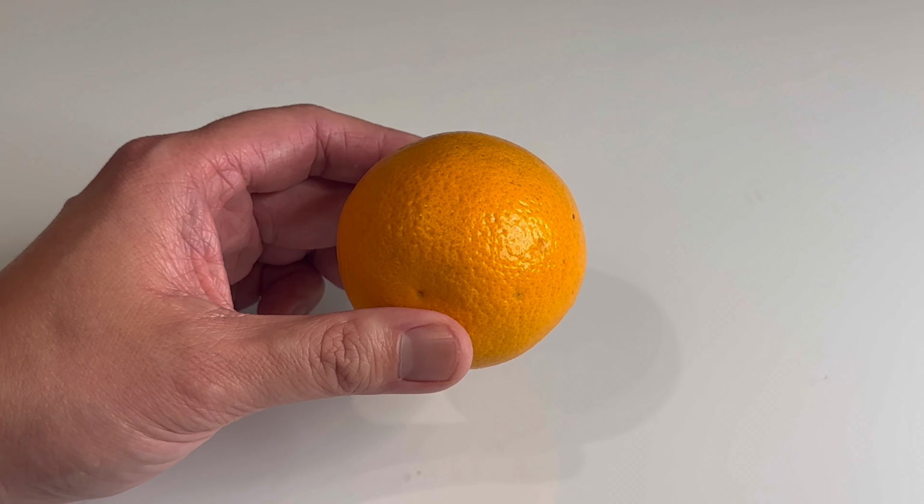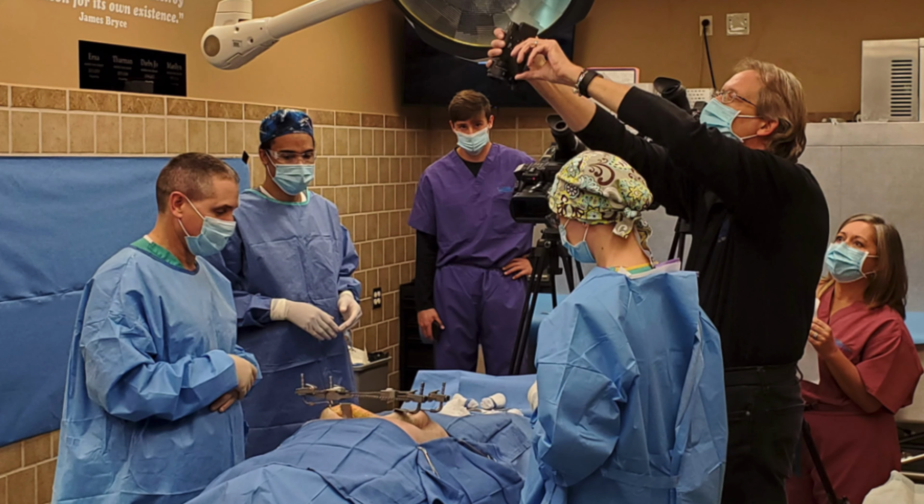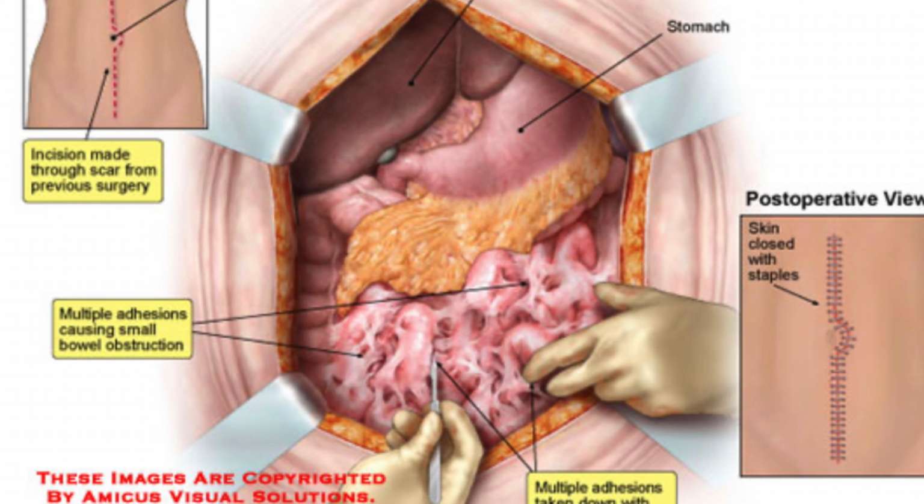On top of this one, if you're doing the procedure open, proper placement of retractors is important because you need to be able to put all the other organs which are not necessary in the field away and retract the abdominal wall.